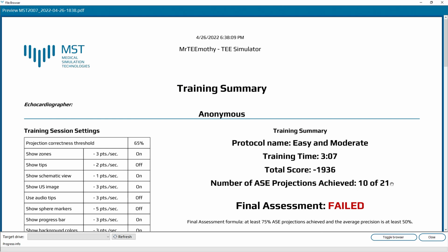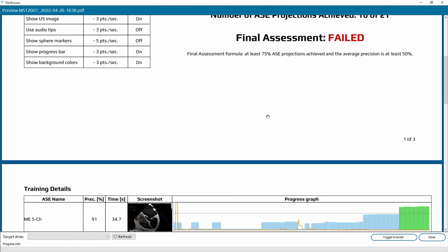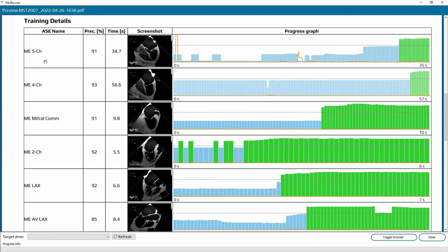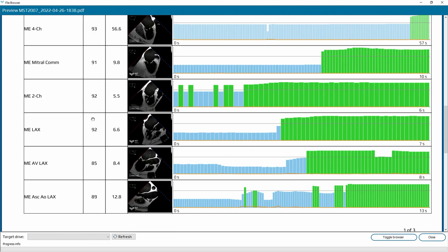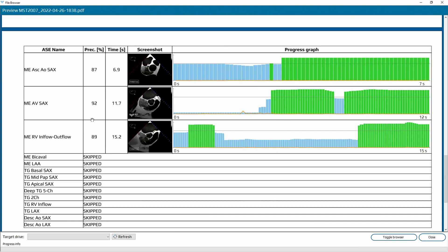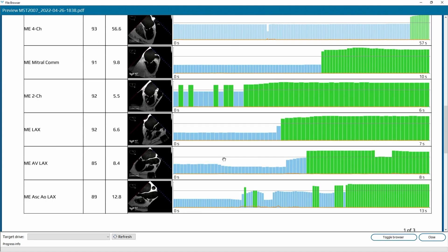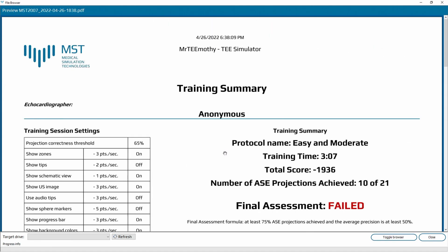I was about to do 21 images but I only did 10 in three minutes and seven seconds. Here you see the images I achieved, with the time needed in seconds and also the precision in percent showing how precise I was in getting those images. I skipped all the others — that's why I failed. But this report can be used to improve your skills.